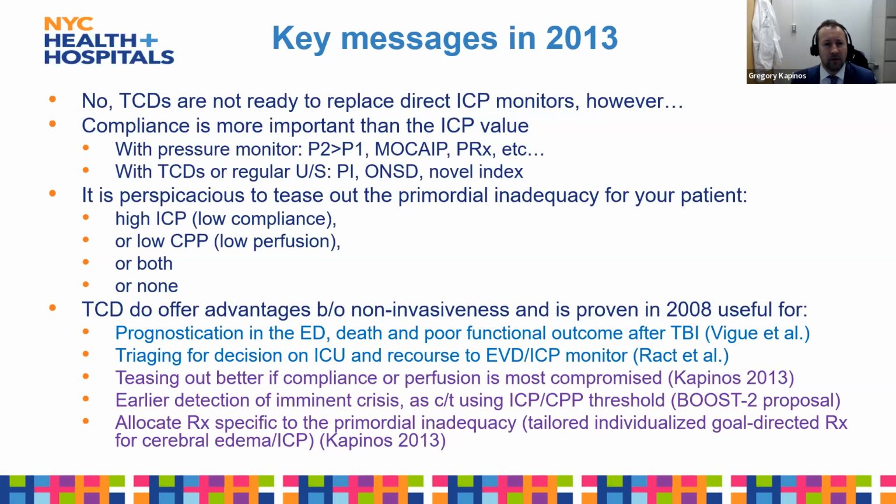When you think about it, the pressure goes up only in a late fashion, and compliance early on can tell you when something is wrong in the skull of your patient. So compliance to me is more important than the ICP value, and definitely the mean value that is displayed and that has been held as thresholded at 20 or 22 for more than 5 minutes and unprovoked as the definition of a crisis that we need to address.